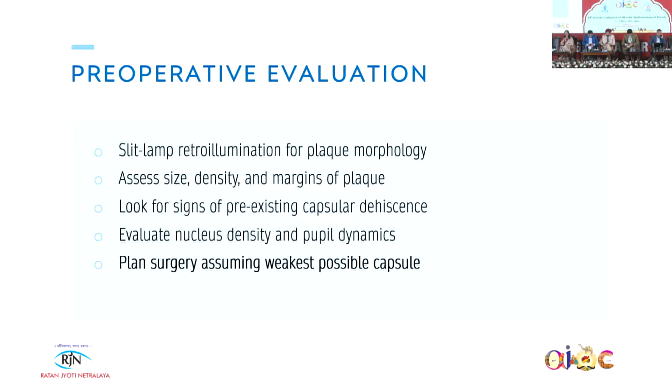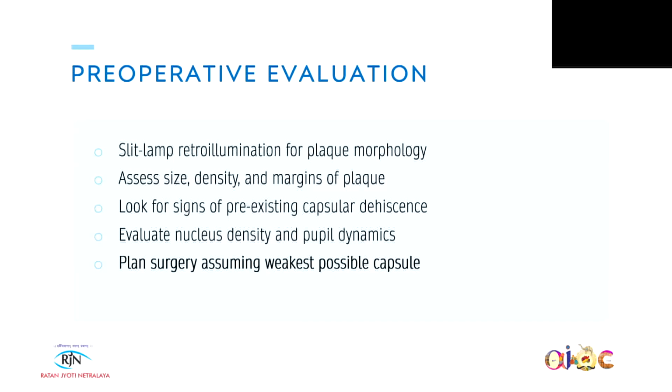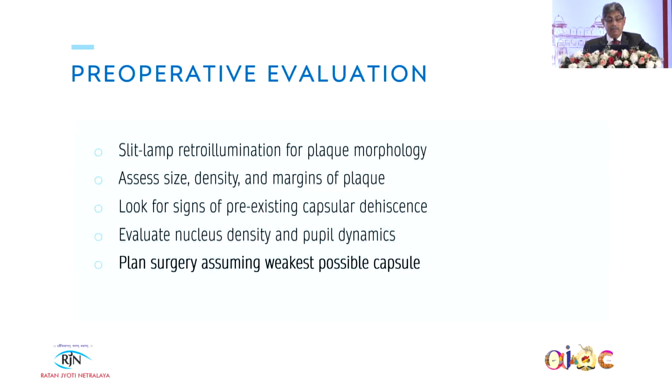And we should plan all these cases, as you saw that in up to 35% you get a PC rent, but we should assume that all these cases have a weak posterior capsule, so we should presume this and perform the surgery thinking this way only.